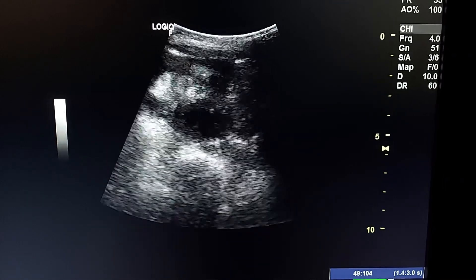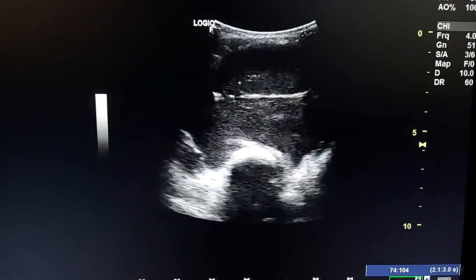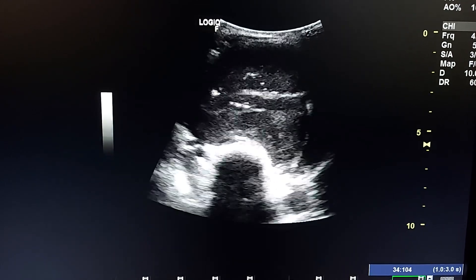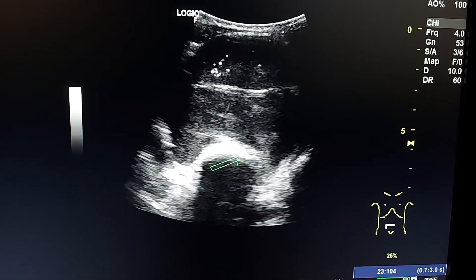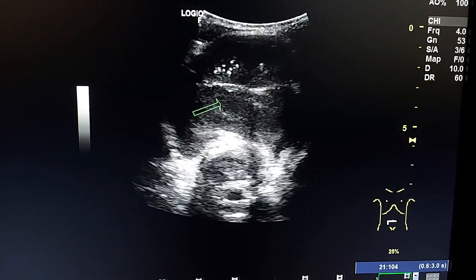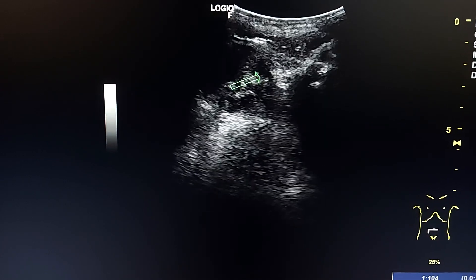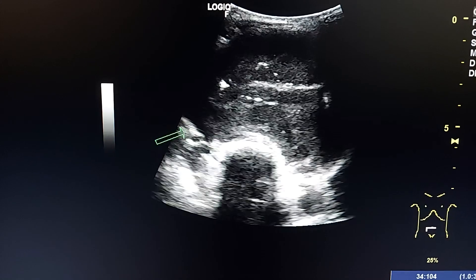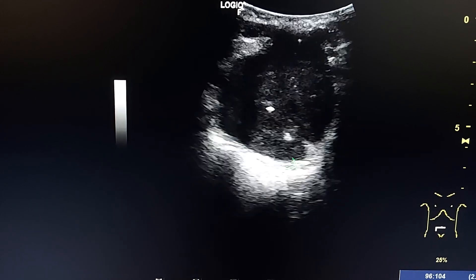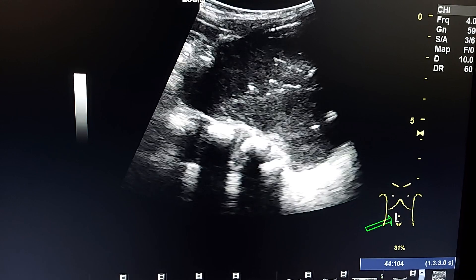This is an ultrasound case of an abdominal mass discovered incidentally in a five-year-old girl. This is a transverse view of the abdomen. We see the mass with punctate coarse calcifications. The mass is hypoechoic, lobulated, and surrounds the anterior aspect of the vertebra. This is a sagittal view.